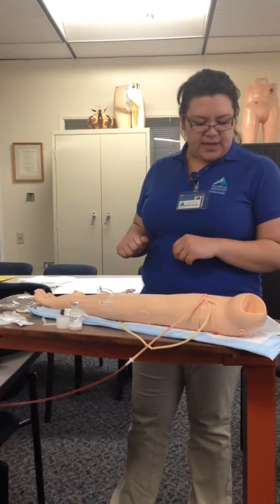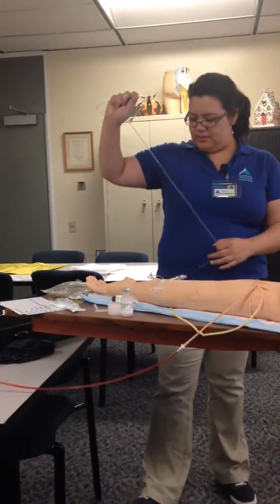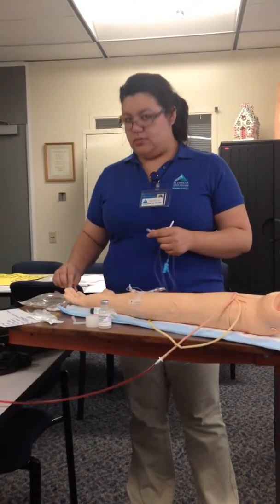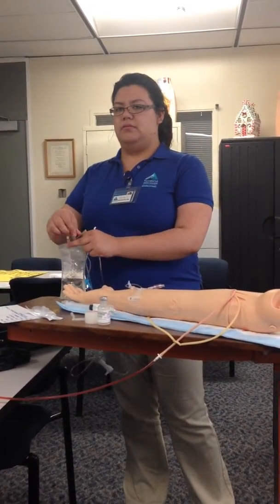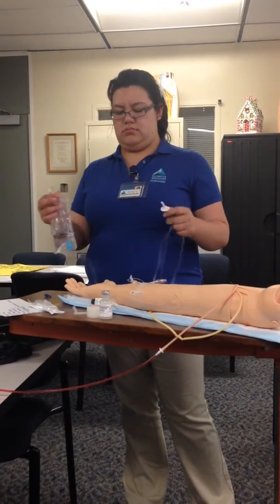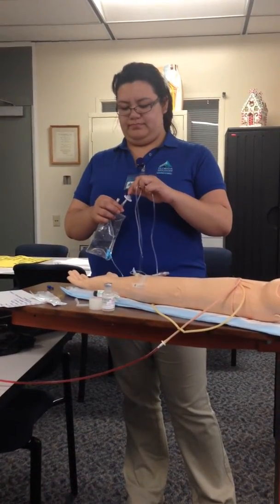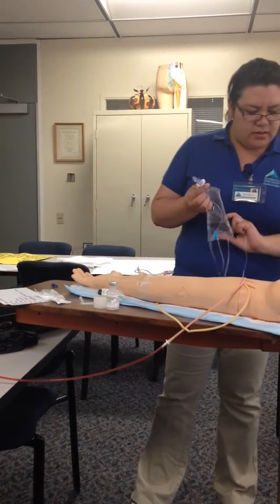So I'm going to attach my tubing to my bag. Clean with alcohol.